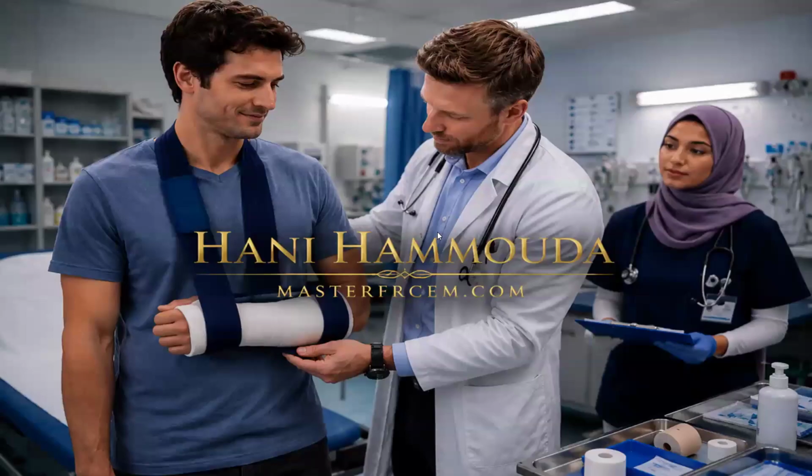All right. Now I am going to hang the patient's arm in an arm sling and collar. Then checking again the pulse, the radial pulse. So, Mister, can you please wiggle your fingers for me? Okay. Do you feel this touching the tips of your fingers? Okay, good. Checking the neurovascular status after applying the posterior slab.